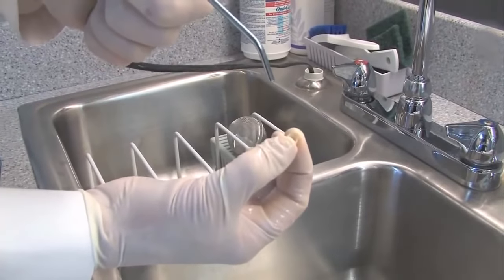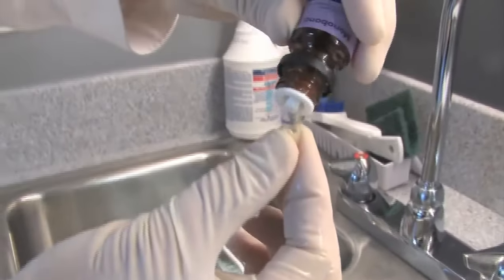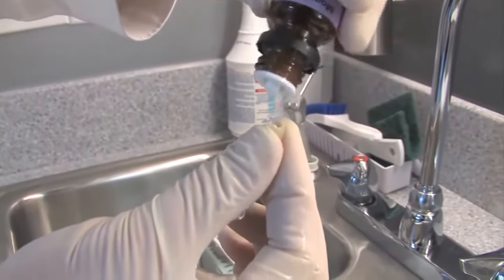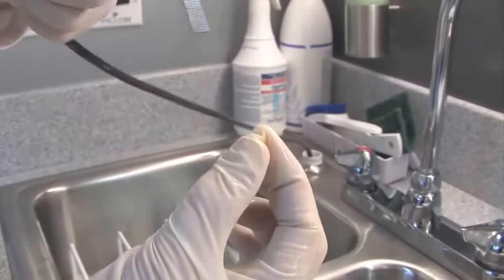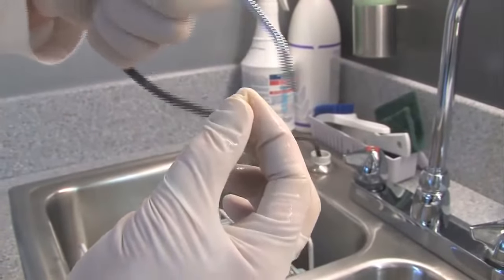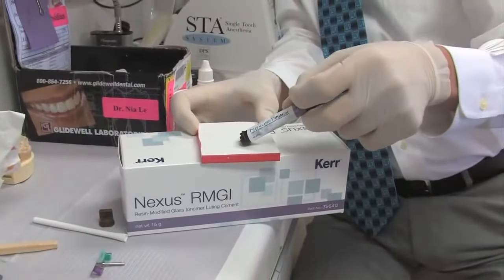Because it's a liquid zirconia oxide, any of the phosphate groups from the saliva that were bound to the zirconia crown are now going to be bound to the purple liquid, and we're going to rinse it right out of there. Now we're going to put a zirconia primer on the inside of this crown. We've placed the zirconia primer and we're going to hit it with some air.